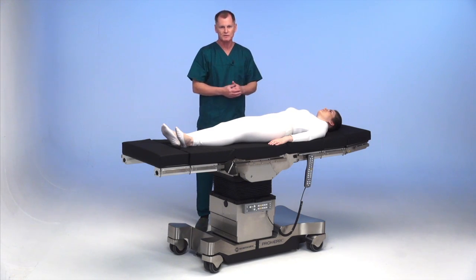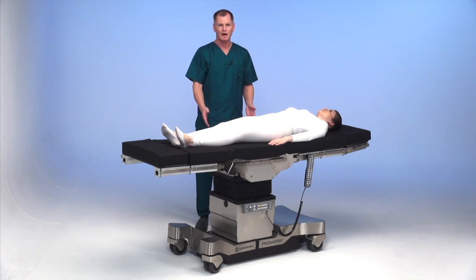The other armboard can be placed onto the table. The table should be locked and you are ready for surgery.